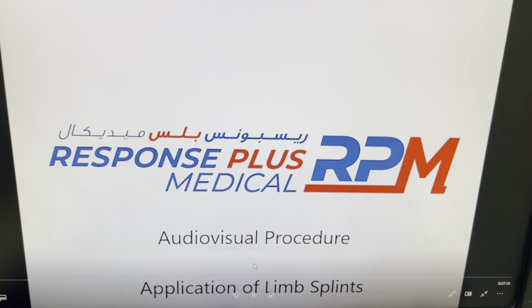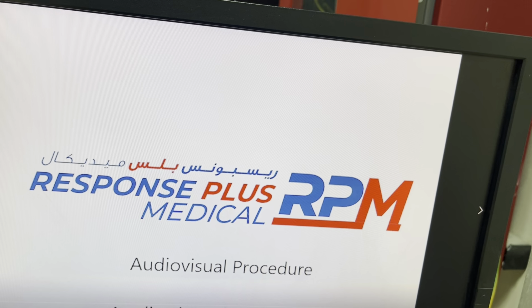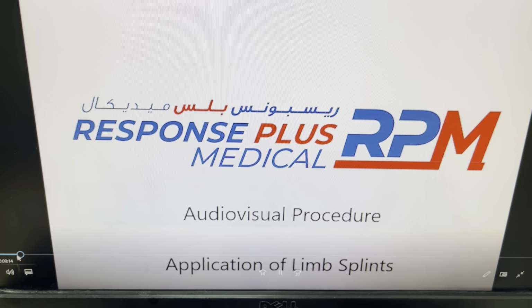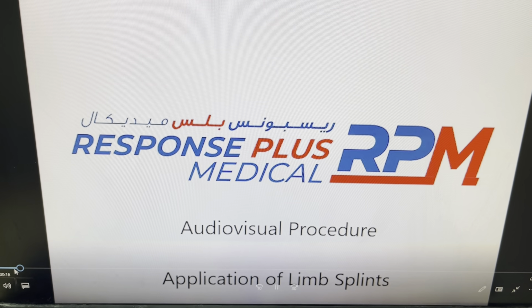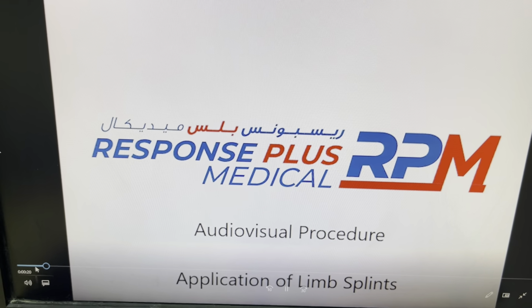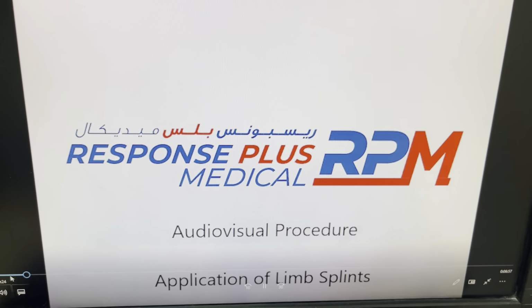Procedure training video series. In this video this skill is performed in patients suffering sprains, strains, dislocations or fractures, among other indications. Using the following steps, in addition to those in the assessment instrument, you will be able to correctly apply limb splints.